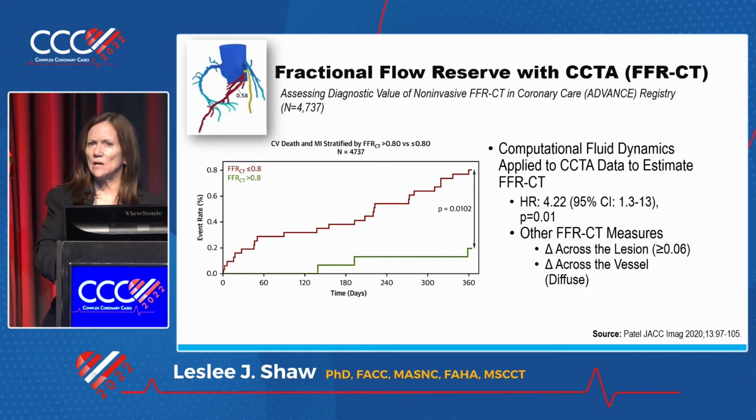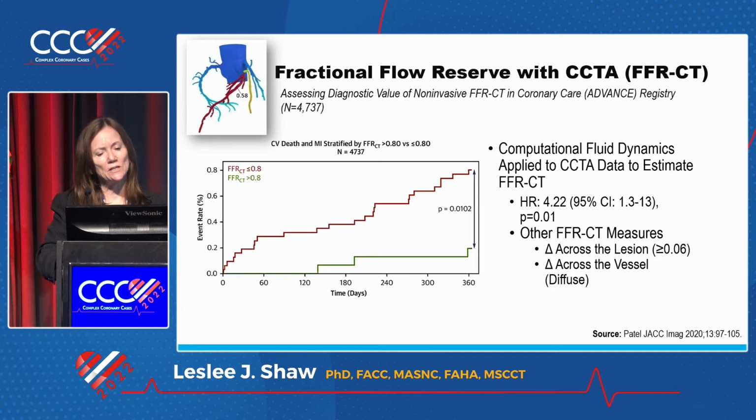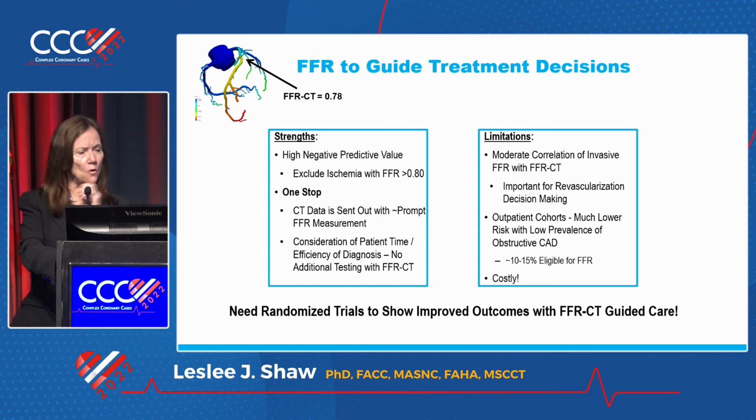There are some other CTA measures which I think probably hold more promise, including the delta of the FFR across the lesion. Some people also like to use the delta across the vessel to get more an idea of diffuse changes. But importantly, what has transpired in the literature is there's been a lot of fluctuations on where you measure the FFR-CT, which has led to a lot of variability and accuracy. We've come to the conclusion that you should measure it close to the stenosis. I know that sounds like brain surgery that the imagers came up with, right? We figured it out, you should measure it close. But people were so eager to get a reduced FFR that they would often go much more distally, and then they showed a discordance with invasive FFR.